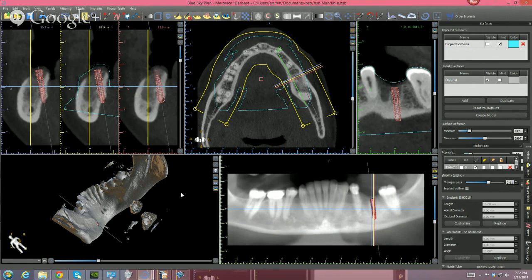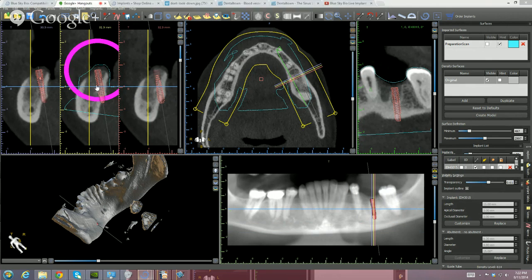Don't go there. When we teach live surgery and training, one of the things that we tell people is that in the posterior, you're never putting in anything bigger than a 10 or 11 millimeter implant. As a matter of fact, we prefer 8s, 9s, and 10s. There's no reason to go any longer in the posterior. That's a whole different discussion, because most of the studies show there's no reason to do an implant that long. Implants of proper dimension do very well in the 6, 8, 9, 10 millimeter category, no problem. But anyway, I just wanted to show you what I meant by submandibular.